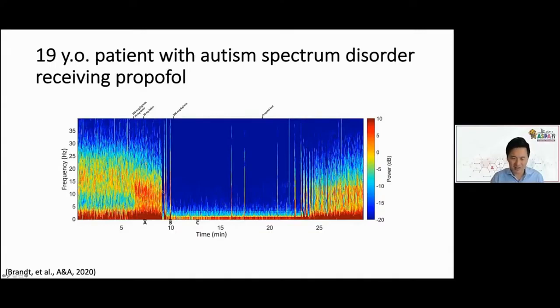I mean, why is it that this patient is basically isoelectric? Their brain is completely shut off, no neural activity for 12 minutes. That's unacceptable. That's way more anesthetic than you would need, even after turning down the infusion to 200. And then the patient emerges, but as we know, it's really a delayed emergence, 2 hours. That's unacceptable, right?